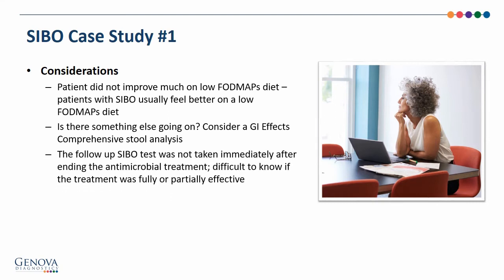Another consideration is that her follow-up SIBO test was not taken immediately after ending the antimicrobial treatment, so we don't know if the antimicrobial regimen was fully effective or not. If the follow-up test had been administered right after finishing the regimen and we saw these results, then we could conclude that the treatment was not effective. In that case, choosing a different treatment might be appropriate.